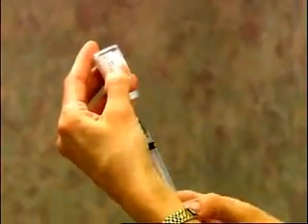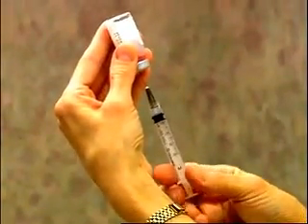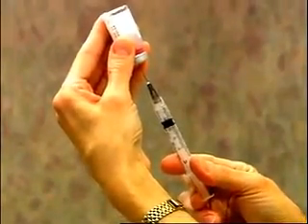Now invert the vial and make sure the needle tip is in the solution. Withdraw the ordered dose of medication by pulling back on the plunger.